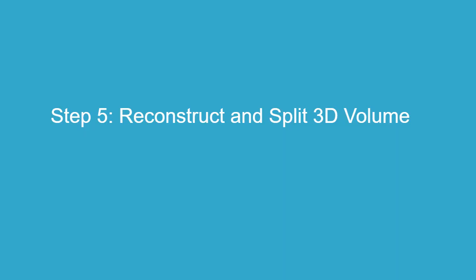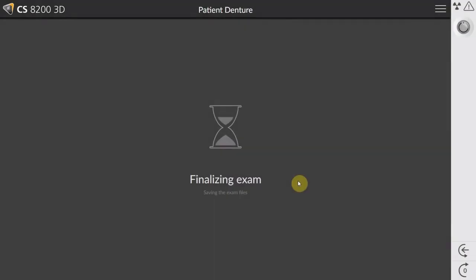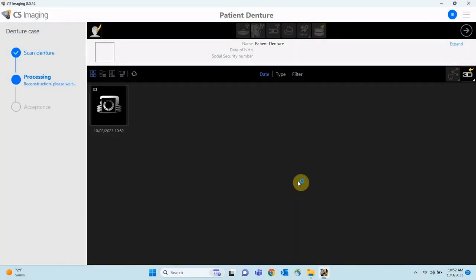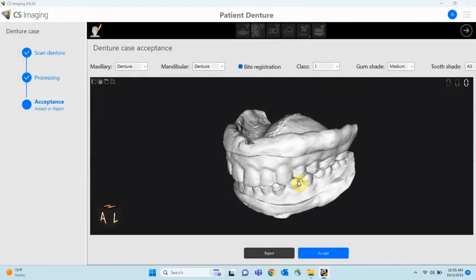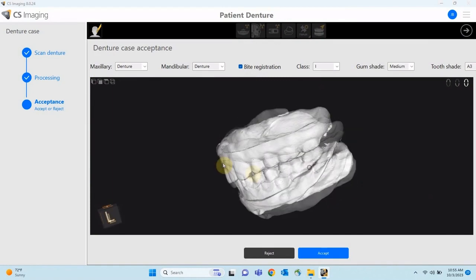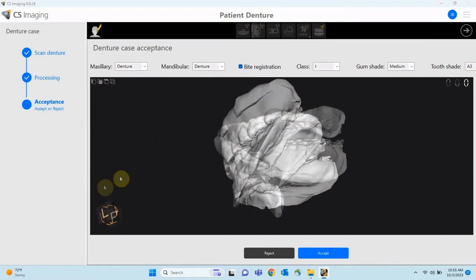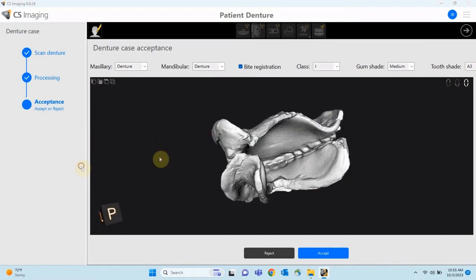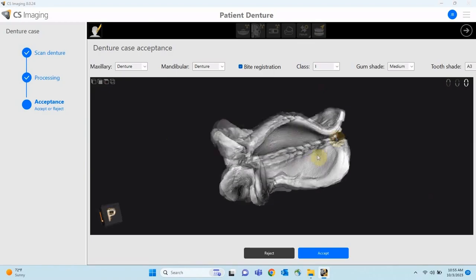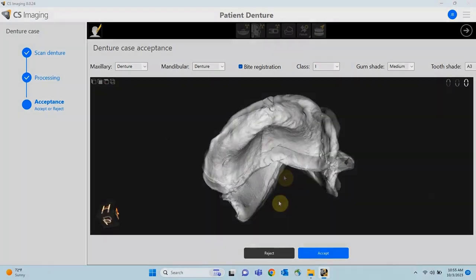Step 5: Reconstruct and Split 3D Volume. After the scan is complete, the imaging software generates 3D models of the dentures. Allow the software to create a 3D rendering. The system will split the CBCT DICOM into two separate STL files.